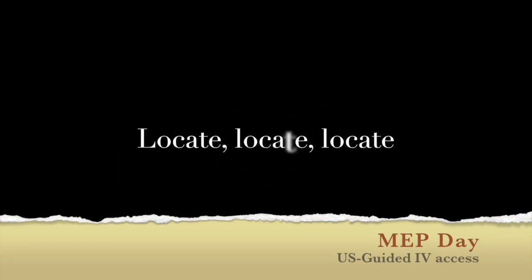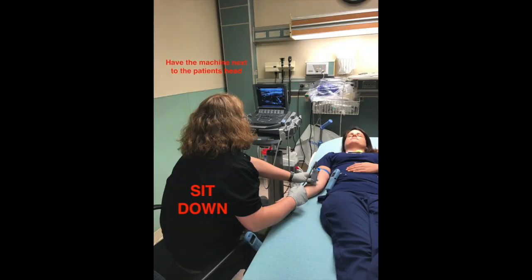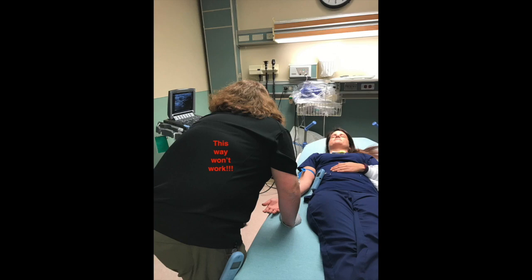Ultrasound guided IV access is all about locate, locate, locate. First, locate the correct patient, confirm you can use the arm for IV access, and locate yourself relative to the patient so that you can easily and comfortably see both the patient's arm and the ultrasound screen.